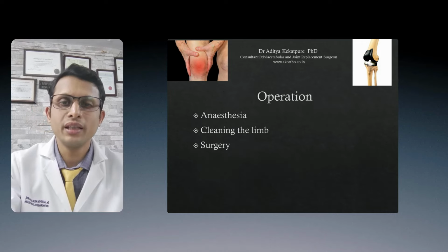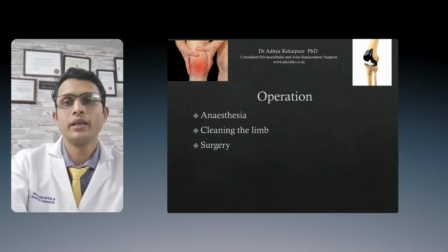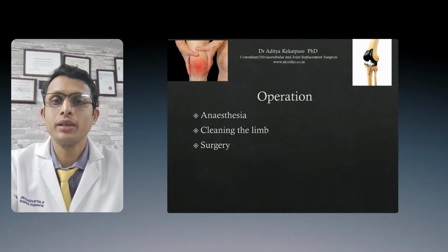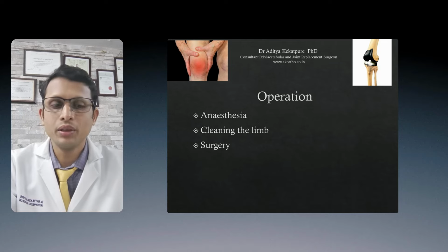Basics about the operation: whenever you are planned for a surgery, you will be taken to an operation theater. You will be given anesthesia. It can be regional anesthesia or general anesthesia depending on your medical condition. The limb is cleaned and then we go ahead with the surgery.